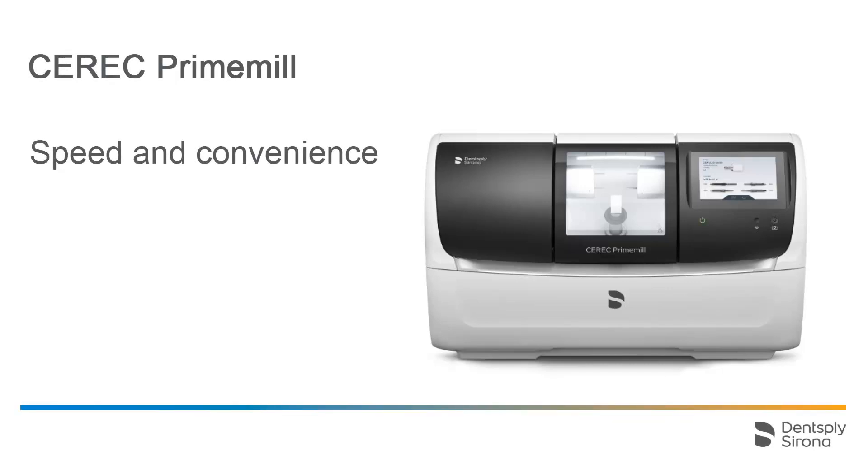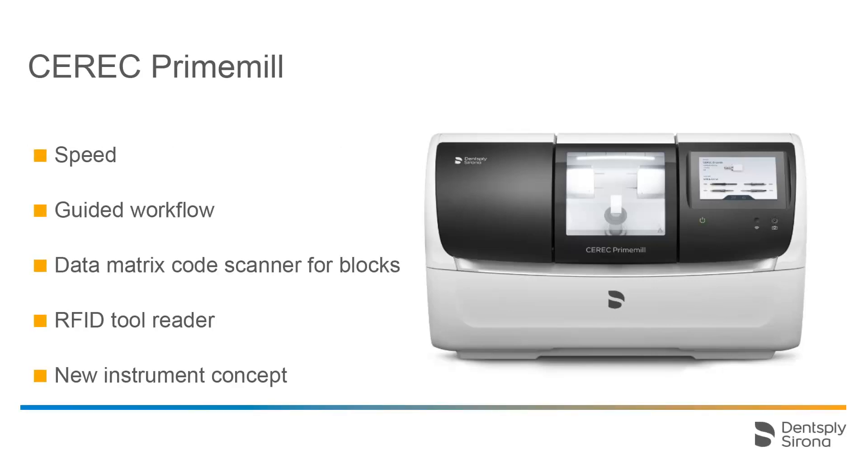Welcome to this video tutorial on the topic of CEREC PrimeMill. In this video, we will take a look at the speed, the guided workflow, the usage of the data matrix code scanner, and the RFID tool reader in more detail. We will also present the new instrument concept.